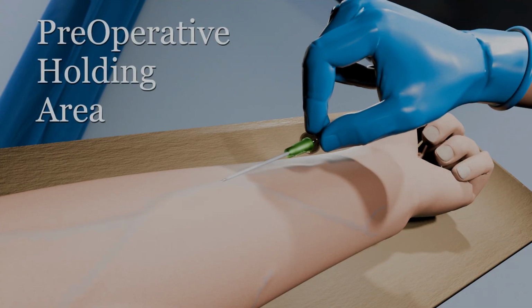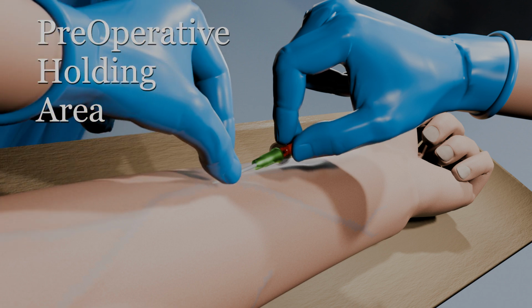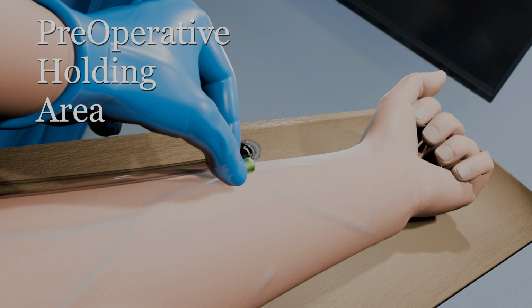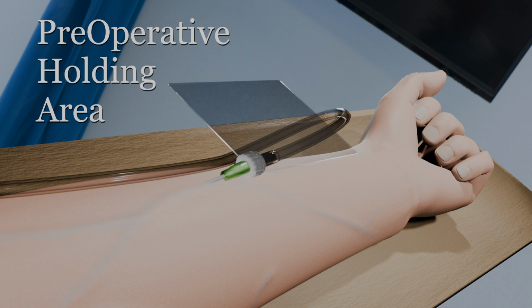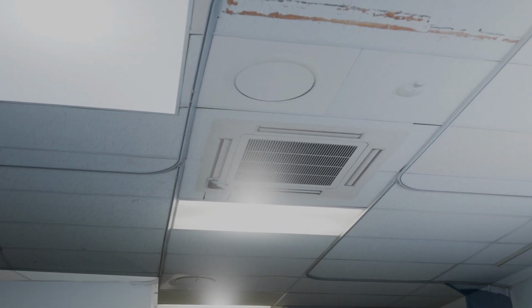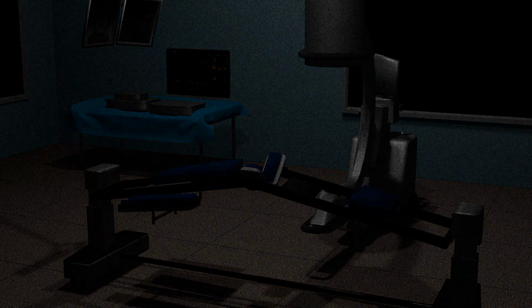The day of surgery, you will arrive at the surgery center having had no food or drink since midnight the night before, NPO. In the preoperative holding area, you will receive an IV and medications to assist with anesthesia and surgery. An antiseptic body wipe will be carried out. You will be transferred to the operating room. A general anesthetic will be administered.